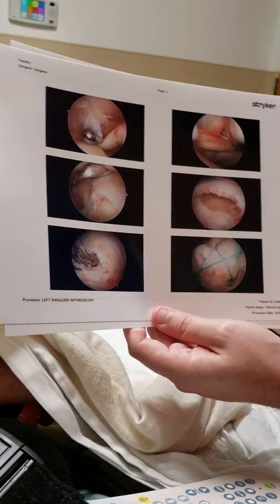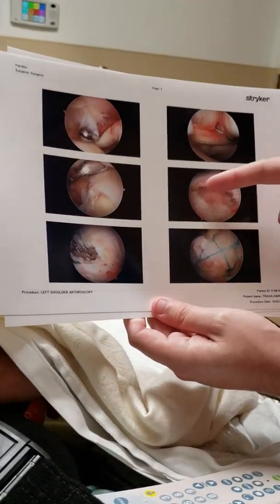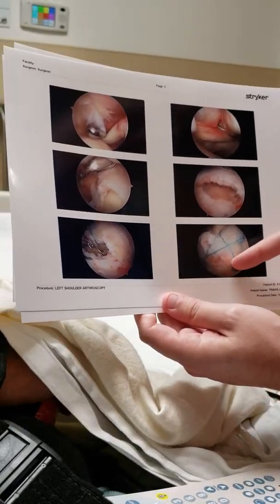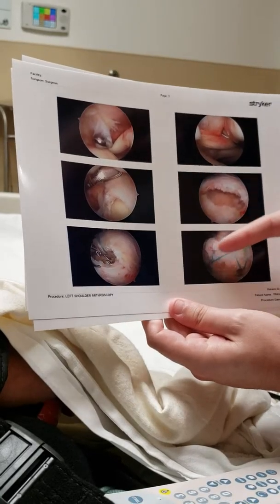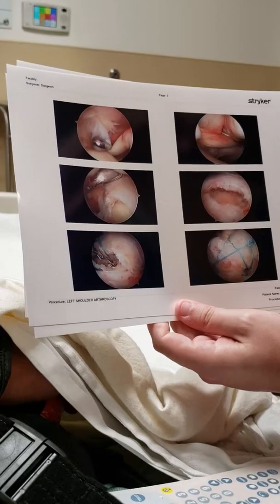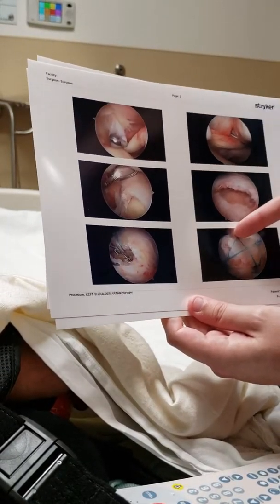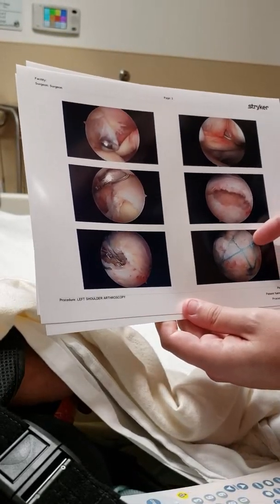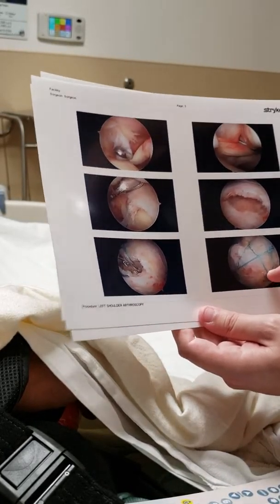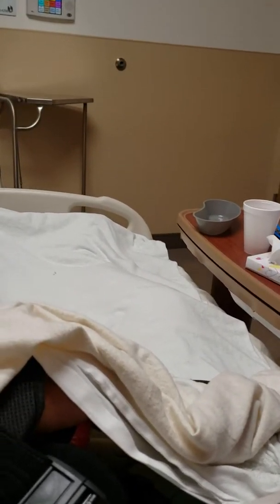Here's the tear, and here are the stitches that were placed — deep above it and then down along the side of it — making like an X across it, pulling all of that down. There are anchors placed into the bone above. The stitches run out of the anchor and cross over the top of the tendon. Then there's another anchor here and here, so it almost compresses or pushes all that tissue down. They tighten it with stitches — we tie a knot to snug it down.